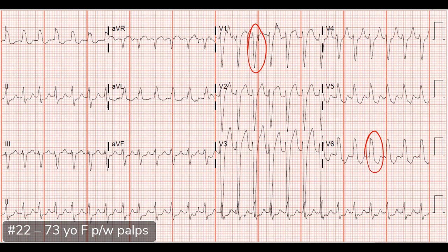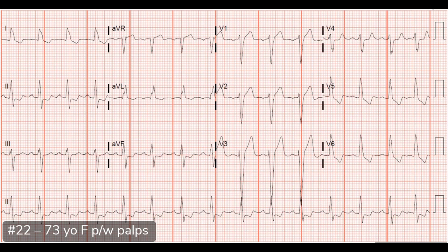This is the ECG we got after she converted — beautiful. It's a left bundle. She didn't have a known left bundle, but she had an underlying left bundle that is the exact same morphology as when she was tachycardic. So this was SVT with aberrancy. There was a little complicating feature: after we got the ECG, she went right back into SVT.